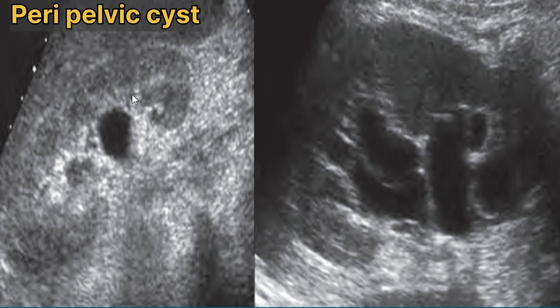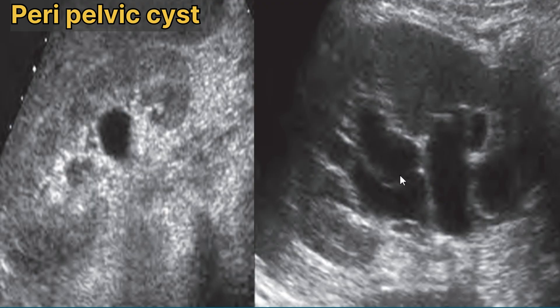Now we will discuss peripelvic cysts. These cysts are mostly formed in the renal sinus and are probably lymphatic in origin. They are frequently multiple and may be bilateral, and are important primarily because they can be confused with hydronephrosis. A single cyst located within the renal sinus can simulate hydronephrosis. Multiple peripelvic cysts, some with a rounded configuration extending into the renal hilum, can also be confused with hydronephrosis.